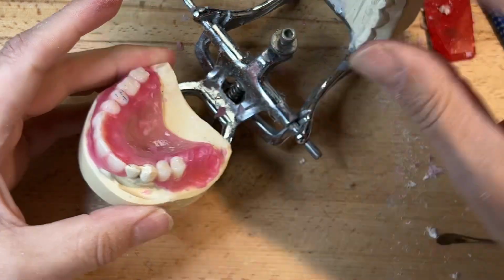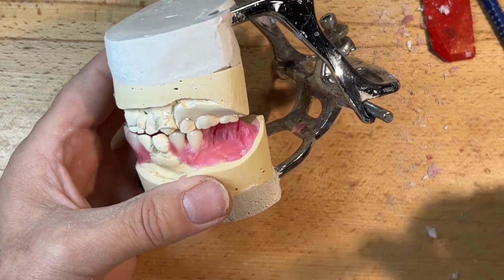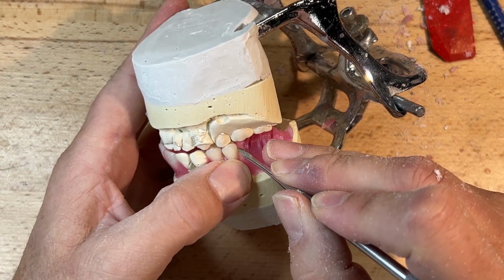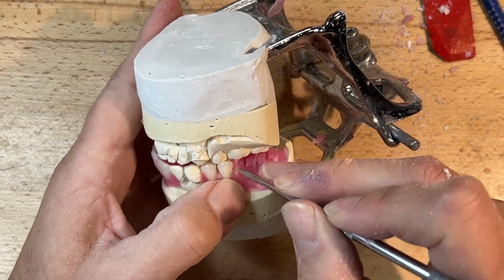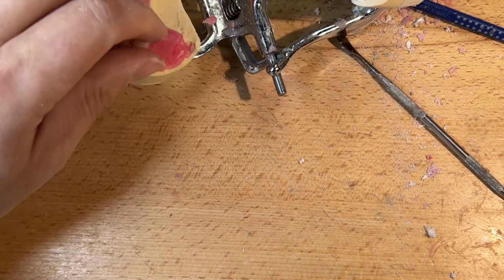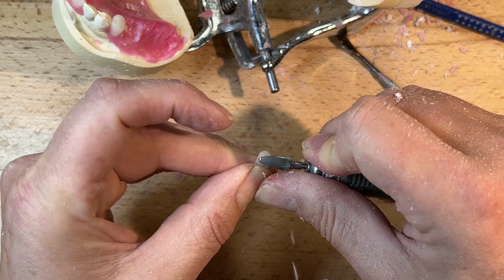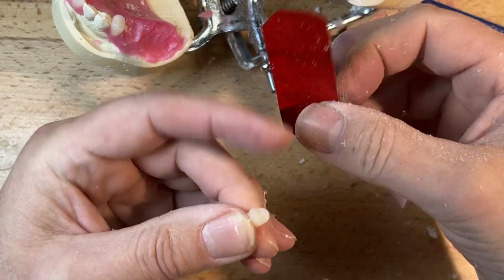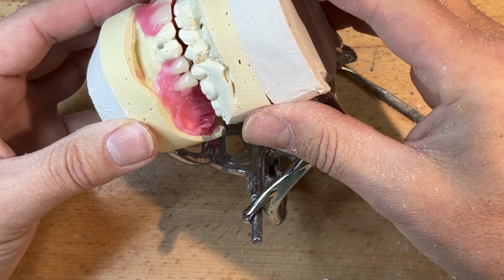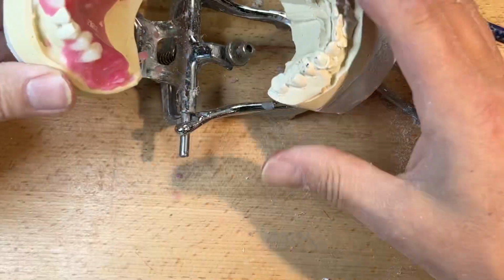Number 5 now. Let's see what we'll have to the opposing occlusion. A little bit narrower of the mold between the lower. There's probably a 31, and this is 31 as well, but slightly different. Okay. Intraorally I would use a cloth articulating paper. This articulating paper, you can get a lot of eccentric contacts if you're squishing that together. So as you can see, I'm using it very lightly so I don't get any kind of erroneous contacts. I'm not holding, just slight markings here.